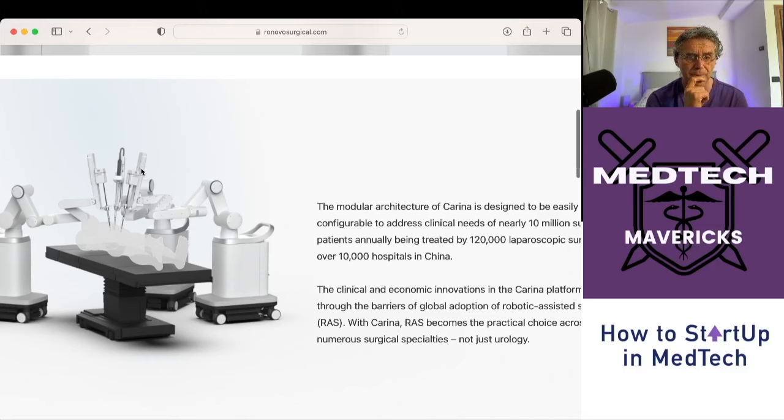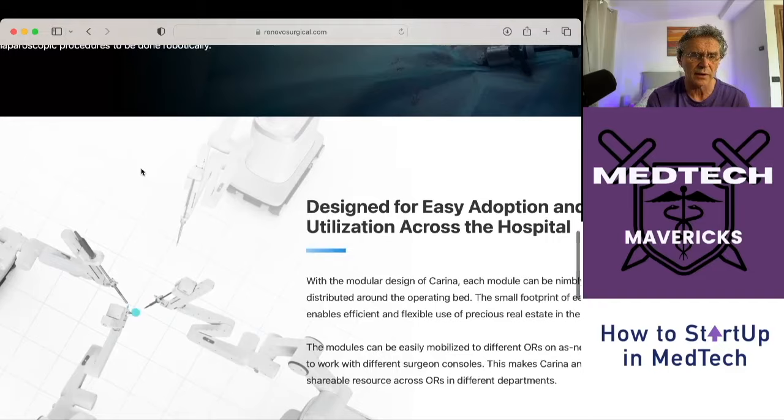You can basically see what the system looks like. The site talks a lot about hospitals in China — this is a Chinese company, and I'll talk about the team behind it because that's really interesting. It's a beautiful looking robot, very, very nice.